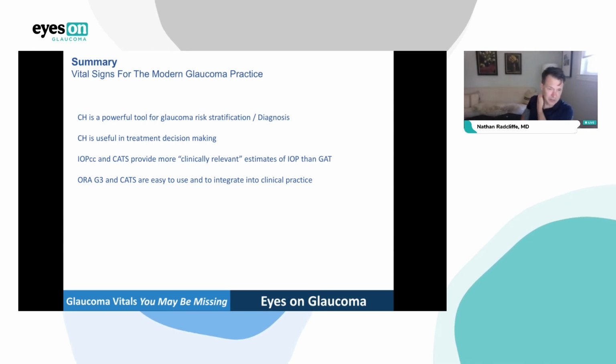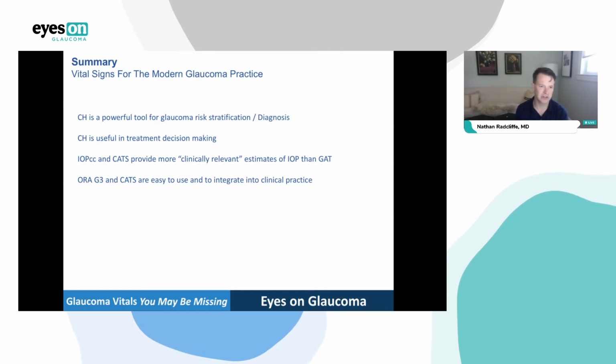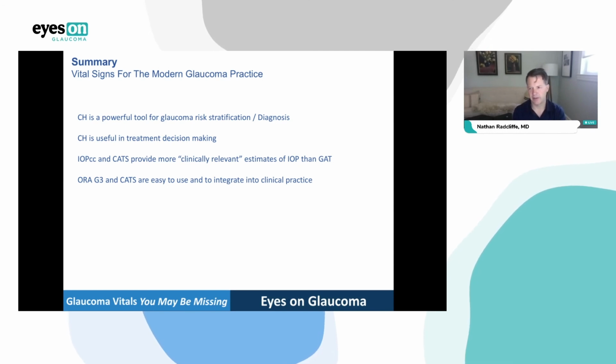My office probably saw 10,000 patients during the pandemic in New York City. We didn't have any COVID infections amongst our staff, and we must have had probably hundreds, if not more, COVID patients without realizing it, given that we were in the epicenter of the pandemic. And we used ORA because we felt ORA at that time was better than Goldmann in terms of how close you had to get to the patient, with a technician 6 inches from the patient. So not validated.